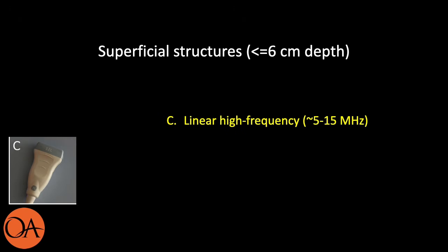In summary, lung ultrasound can be performed with a number of different transducers.